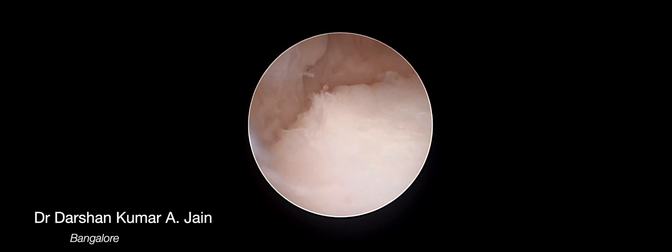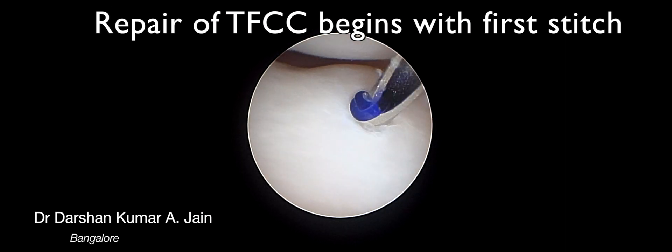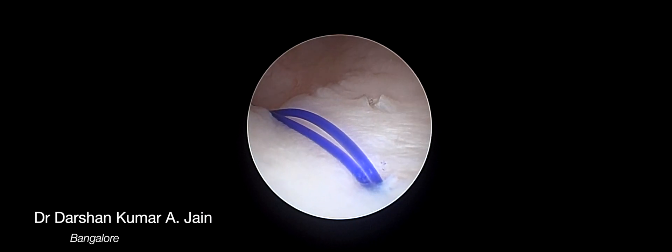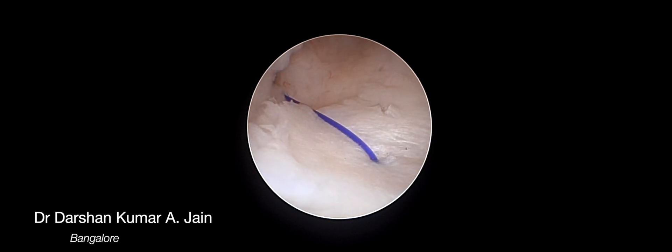Once the debridement is done, the actual repair process starts by passing the sutures, or stitches as we call them in layman terms. In this situation it may require two to three stitches. The first stitch is passed from outside-in and comes out, and the second stitch is subsequently passed.